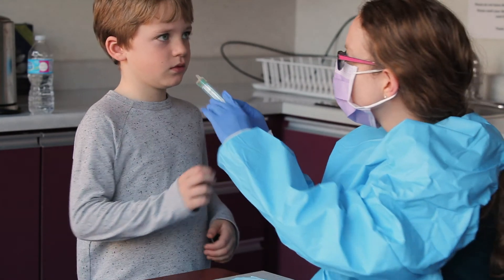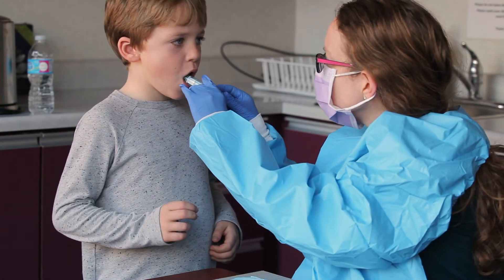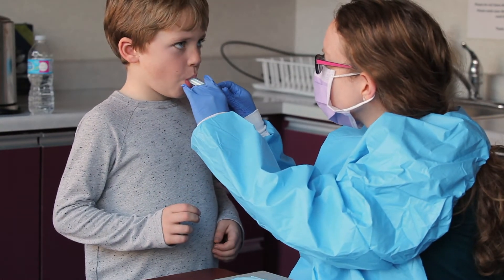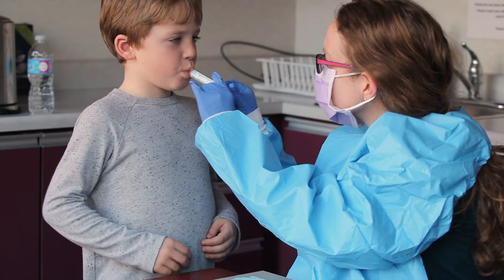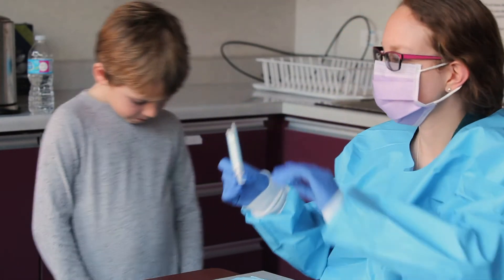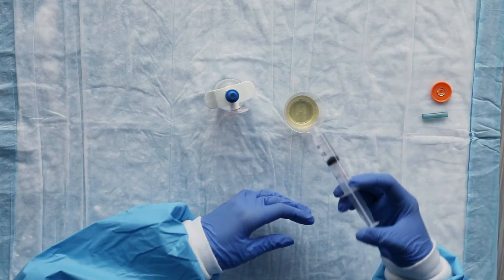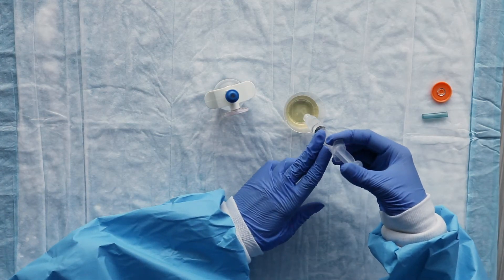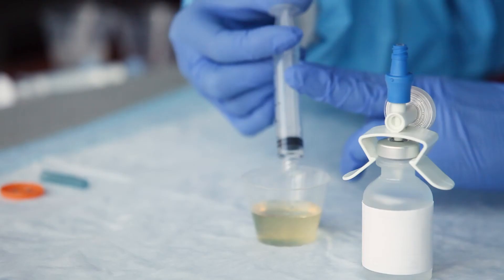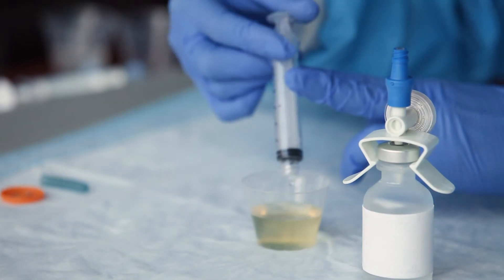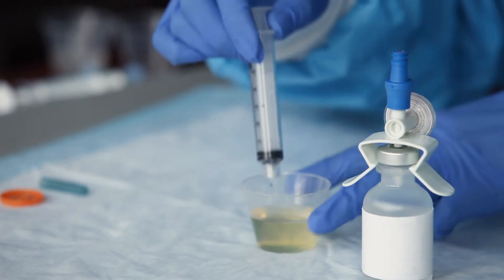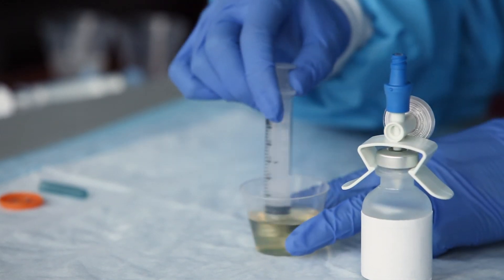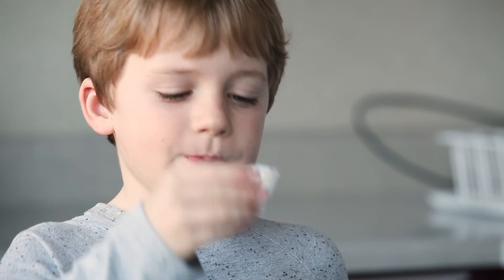Place the syringe into your child's mouth and slowly push the plunger to release the medicine. If your child is unable to take their medicine from a syringe, you can dilute it with the drink in a cup instead. Push the medicine from the syringe into the cup with the drink, stir to mix it, and give the medicine cup to your child to drink. Make sure they finish all the liquid in the cup. You may also give them more of the drink afterwards. Speak to your healthcare provider if your child is having trouble taking the medicine.